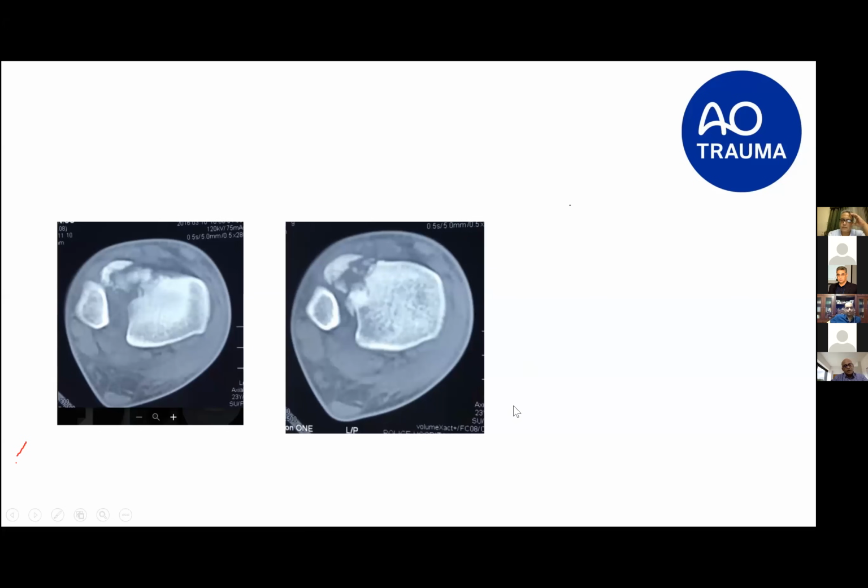The other value for the arthroscopy is at the same time, you might look medially. And then if you see the deltoid is overturned into the medial talar gutter, then you might decide to start medially, remove the debris, release the gutter, and then go back to allow the talus to fall back to where it should. Would you do the arthroscopy after finishing your reduction, or after putting your plates and screws and doing the syndesmotic screw, or before that, or what?